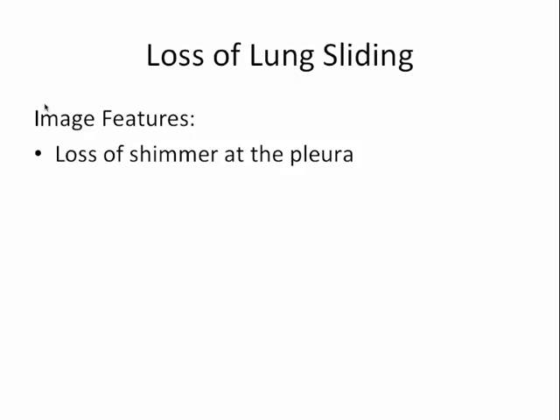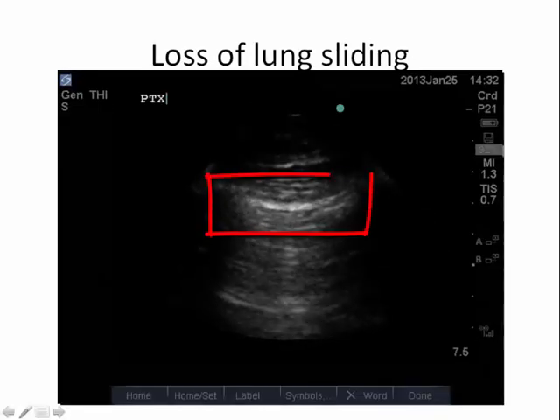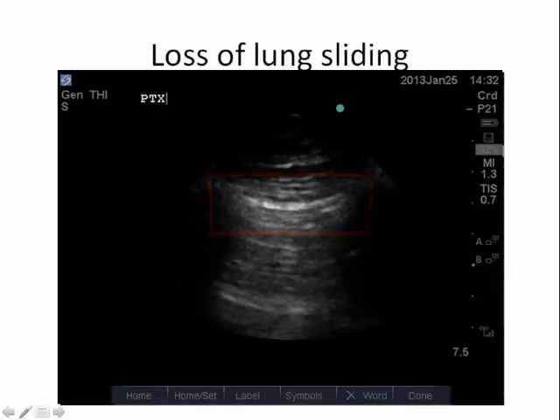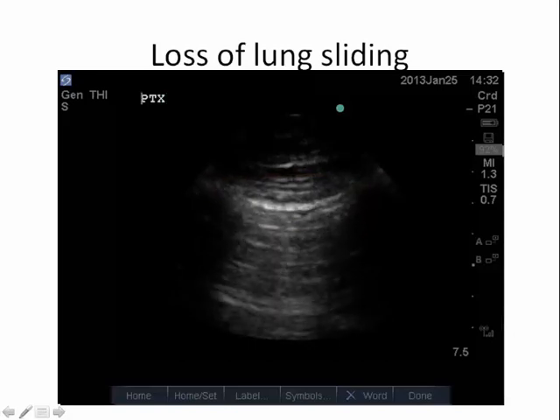Loss of lung sliding is the loss of the shimmer or movement at the level of the pleura with respiratory movement, and this is shown here. As you can see in this patient, there is respiratory movement, but there is none of the shimmer or movement that you would associate with a normal or healthy pleura.